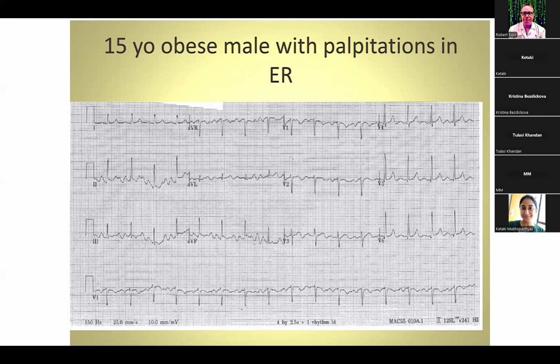So I think what happens is that sometimes when they're doing ablations for things like AFib, while they're drawing their conduction block, you can get some funky rhythms. In other words, until they're done with everything, you can see them sort of block part of the atrium from the other part of the atrium, and some kind of weird looking tracings. There are a whole bunch of those weird looking types of tracings where it's obvious that the left atrium's in fib, but the rest of the heart is not. So it's unusual, but it can happen.